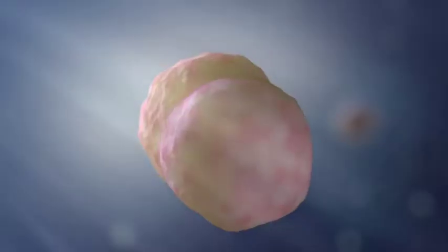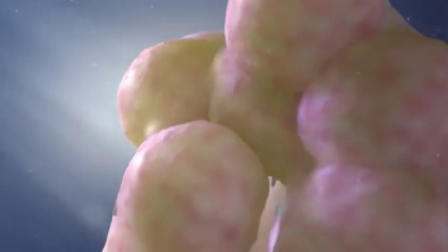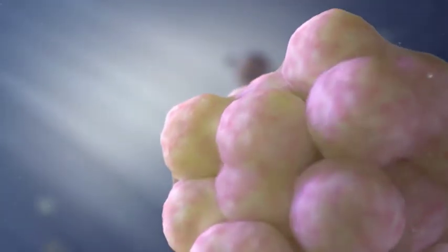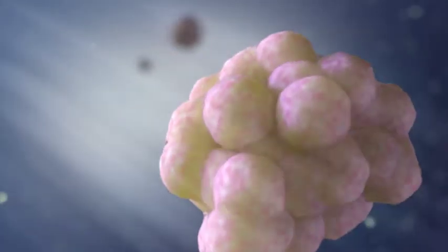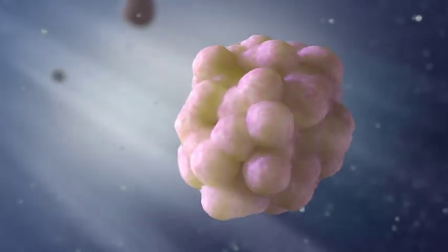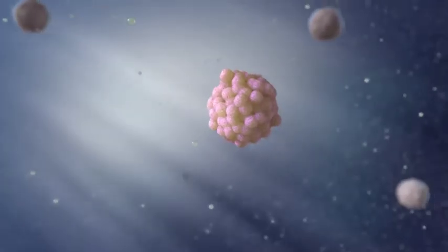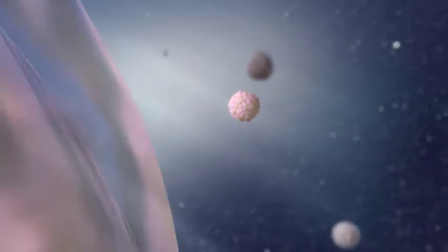At the Englander Institute for Precision Medicine, we culture patients' tumor cells taken during biopsies. The cancer cells are grown in a special gel-like substance which allows the cells to form three-dimensional structures just as they would in the body.